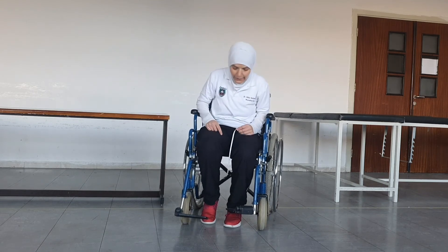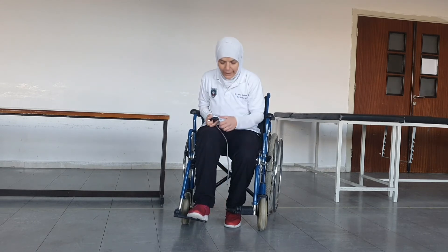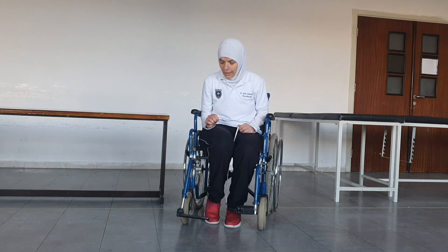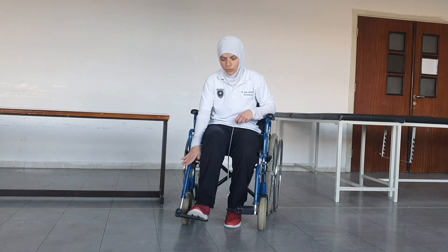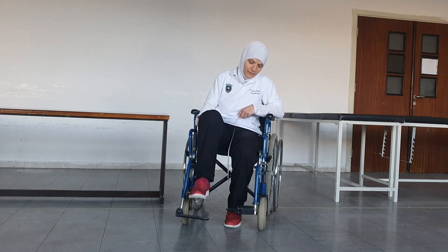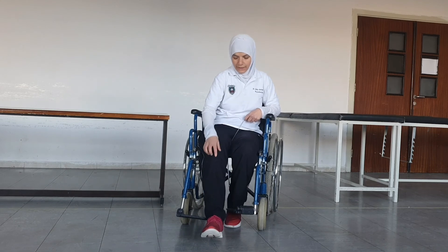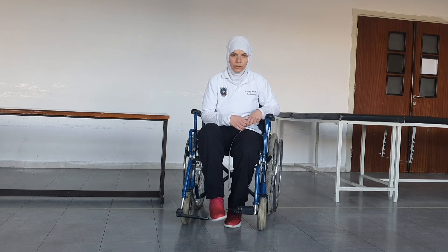The fourth measurement is the leg length, measured from the back of the knee to the floor. This must be correlated with the distance from the top of the cushion to the footrest. If this distance on the chair is too short, the legs will be elevated, increasing pressure on the ischial tuberosities. If too long, the legs will dangle down, which may even cause plantar flexion deformity.